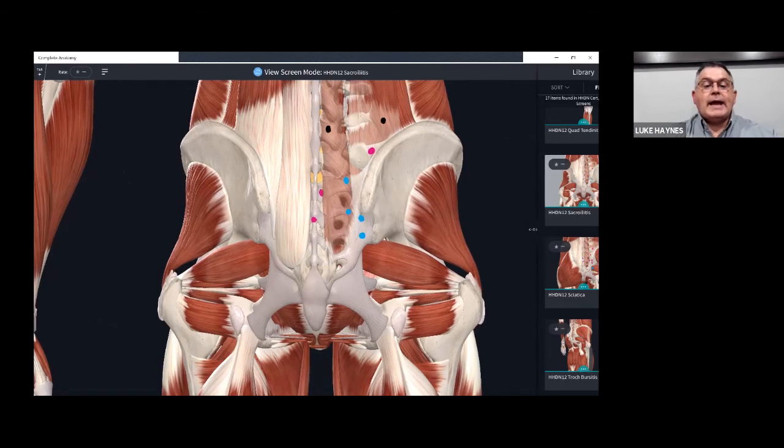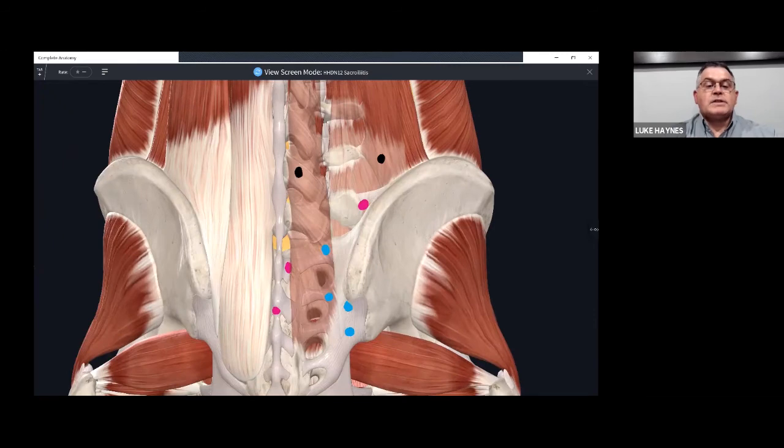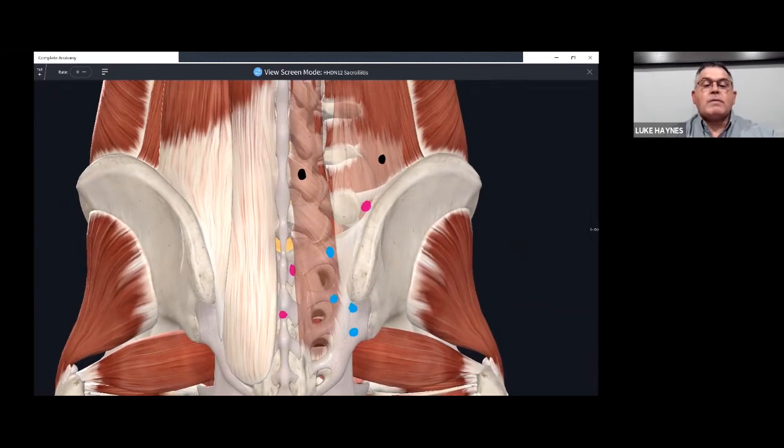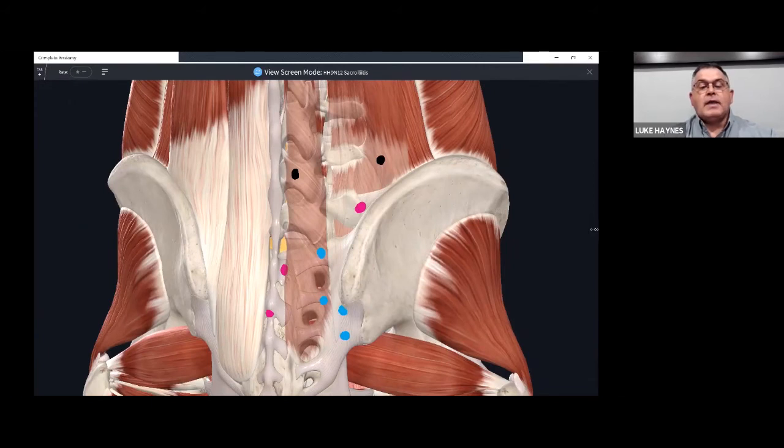So for sacroiliitis, number one, let's look at our multifidus and longissimus, which from the very first lab that we had, one finger breadth lateral from the spinous process, slight inferior, slight medial angulation down to lamina. Iliocostalis, if you recall, that's that profundus grip butting up against the iliocostalis, needling more lateral to medial to address that.